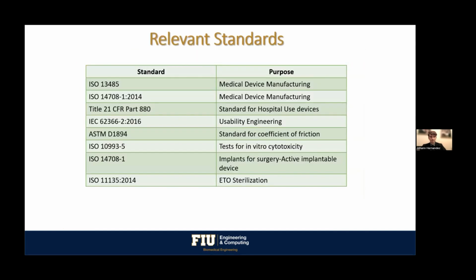Here's some more design inputs and marker requirements. This is a list of various standards that are relevant to the device. We mainly focused on biocompatibility and implantability and the surgical procedure that would go into implanting and using this device.